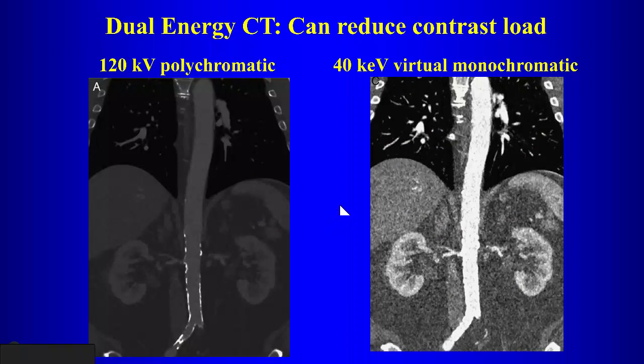Is the downside here just increased dose? What do you mean, radiation dose? No, the downside is usually noise, because these images are much noisier.